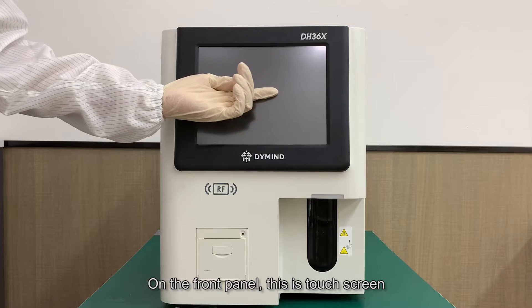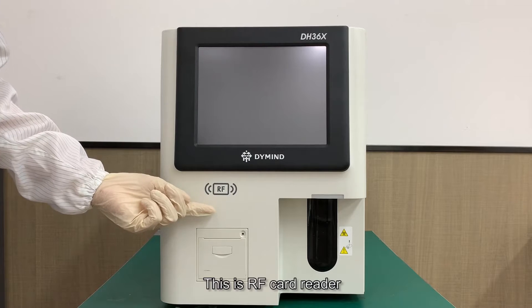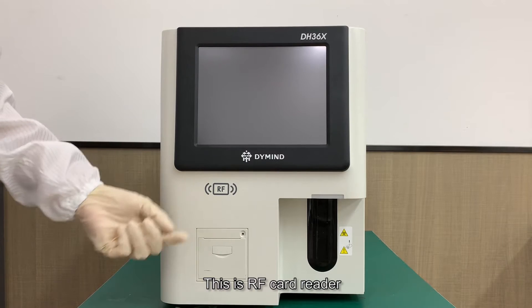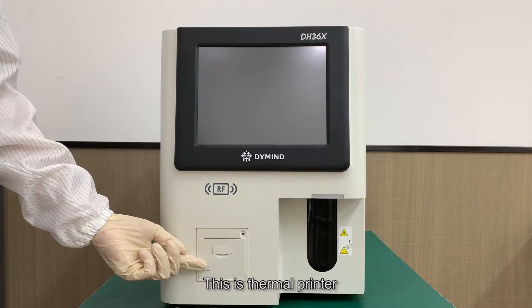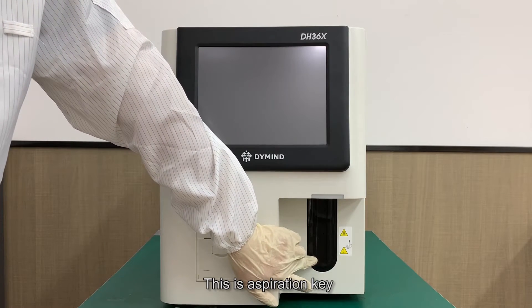Now we are going to introduce the external instruction. On the front panel, this is the touch screen, this is the indicator light, this is the RF card reader, this is the thermal printer, and this is the aspiration key.